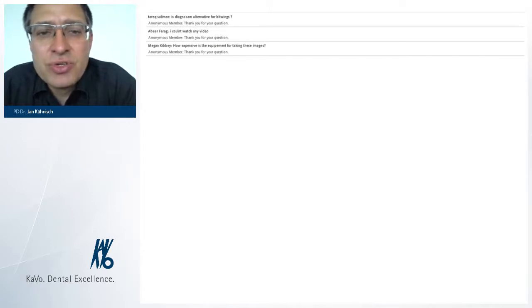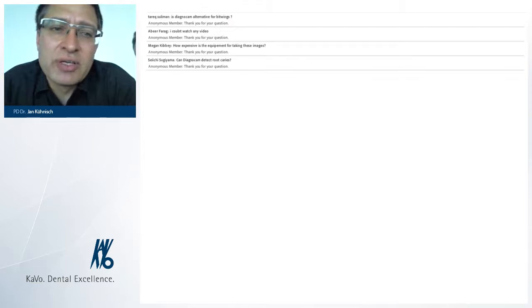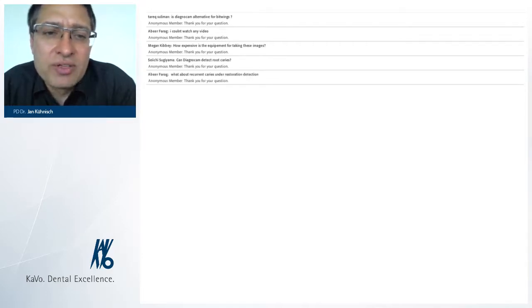And as I had shown to you, it is in my eyes an excellent tool for screening the patients and reducing the number of bite-wing radiographs, which is across Europe definitely an issue in pediatric and dental practices as well, where the patients are asking us, is it necessary to have bite wings? How can we reduce bite-wing radiographs? Do we really need the X-rays? And this is a strong point for this X-ray-free technology. Hope that I fully answered this question for you.